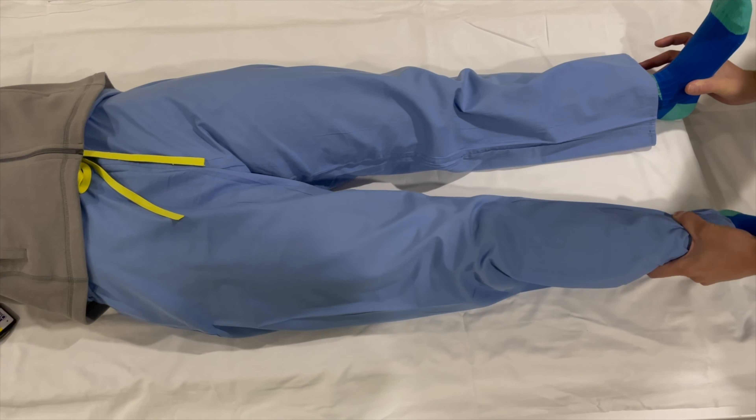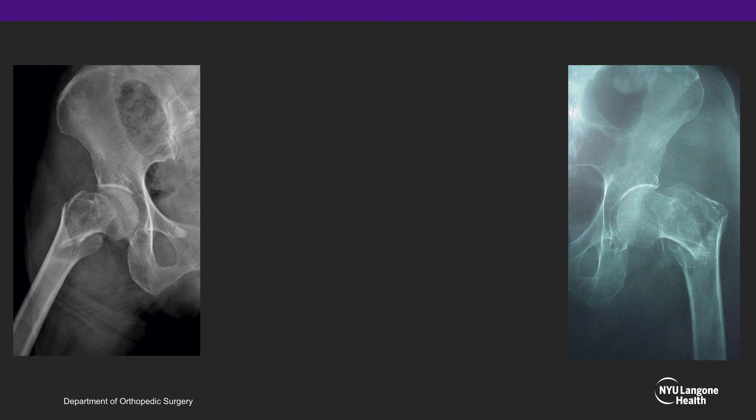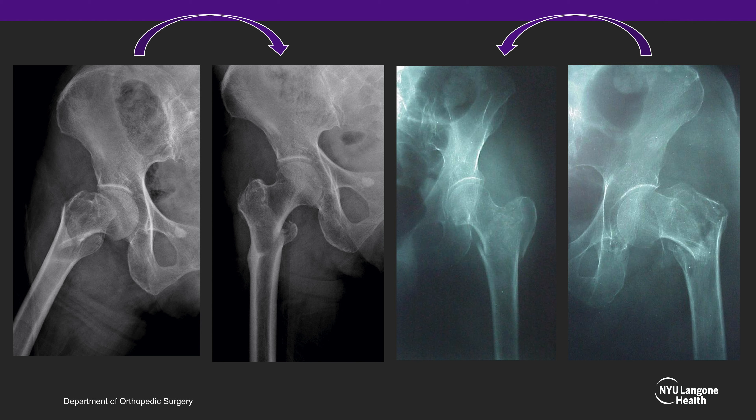The following are examples of two AP hip x-rays in external rotation and shortening. Once traction and internal rotation is applied, the fracture patterns for each can be much better appreciated. The patient on the left was seen to have a reverse obliquity atypical hip fracture near the subtrochanteric region, and the patient on the right was seen to have a reverse obliquity intertrochanteric femur fracture. Both underwent operative repair of their hip fracture with a long cephalomedullary nail.